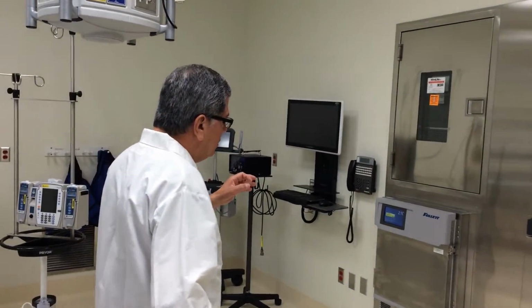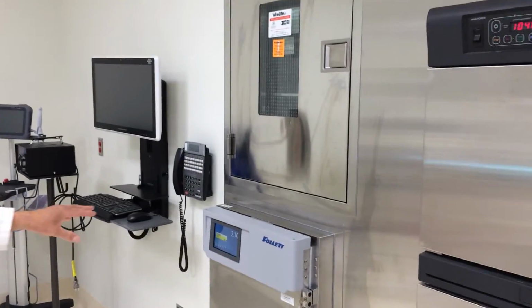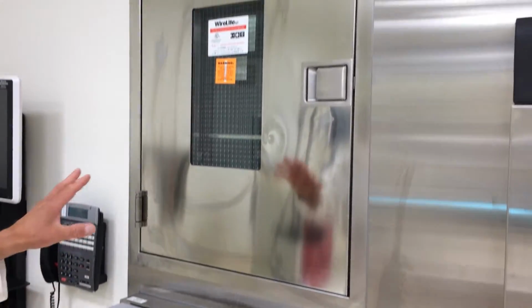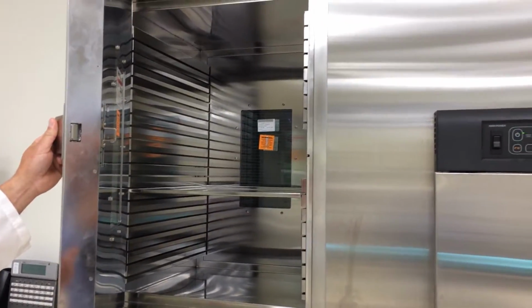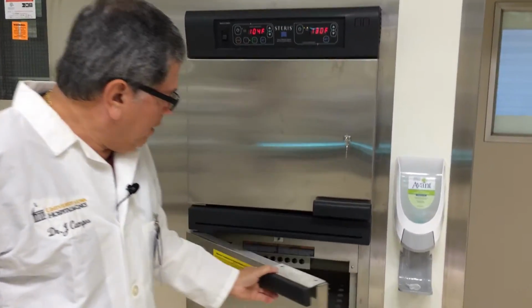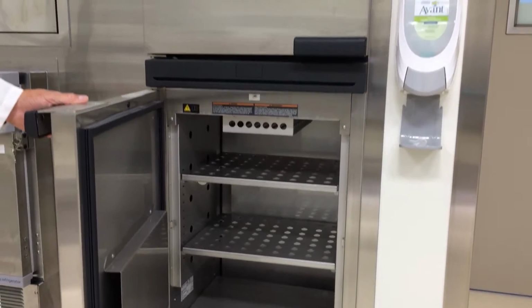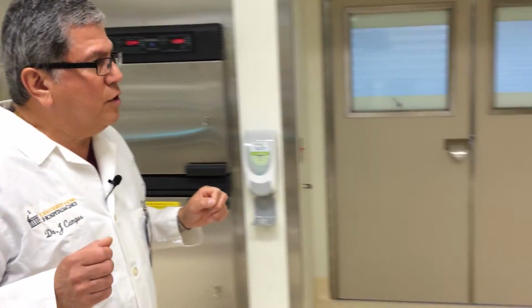Also, we have refrigerators that allow us to store blood or any solution that requires a special temperature. And this is an integrated technology that allows us to set up the specific temperature that is required. Also, we have the pass-throughs that allow us to bring some instrumentation that is required for the surgery. And also we have here the areas where we warm the blankets. As you know, the operating rooms are quite cold, so we want to make sure that the patients are warm prior to being anesthetized, and also we can control the temperature of each room individually.